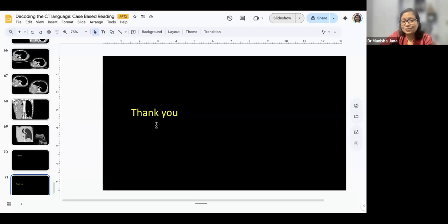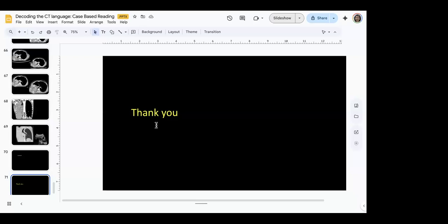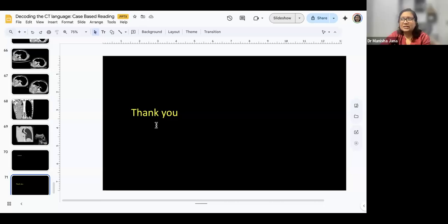What was the second question? Sorry. To ensure the quality is good. Okay. How to ensure the quality?